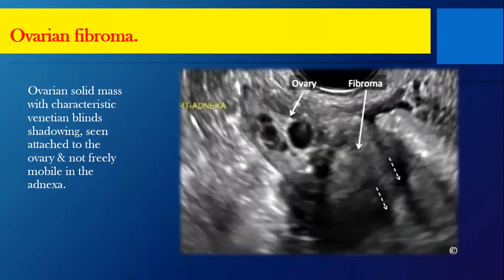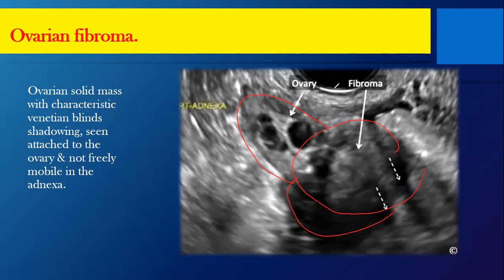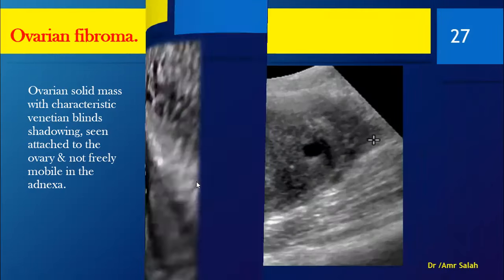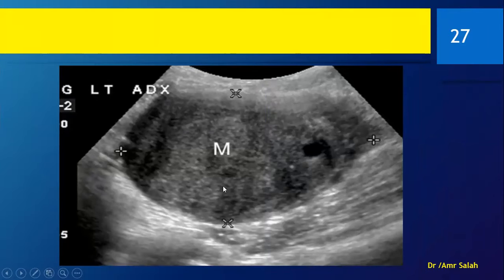Here I have a lesion that is mostly hypoechoic, inside the ovary. I might suggest this is a fibroma. If I see a lesion looking like a fibroid inside the ovary — one, I have to be sure it is inside the ovary, and two, it looks like a fibroid — I would suggest this is a fibroma.